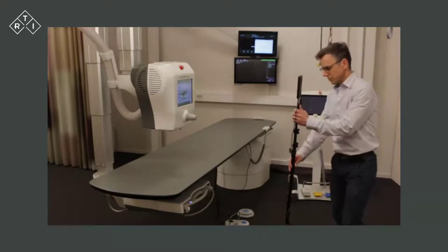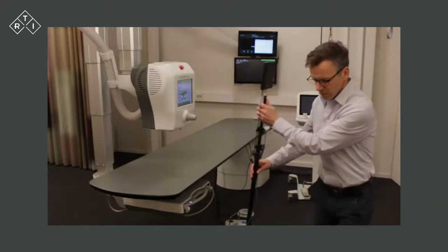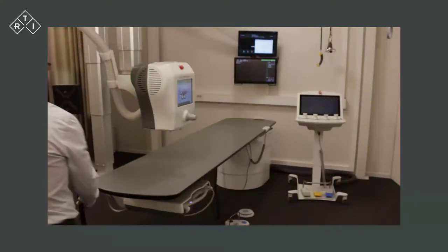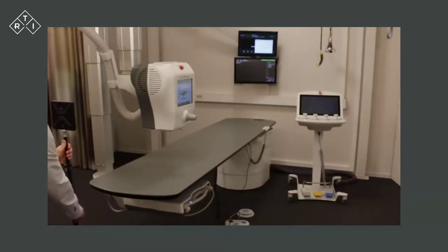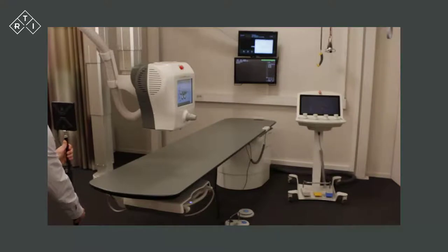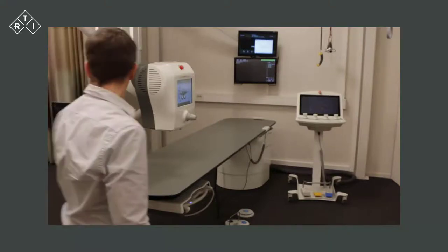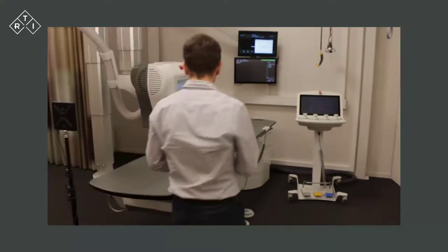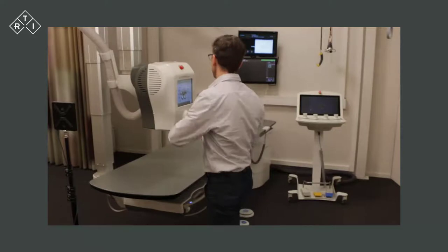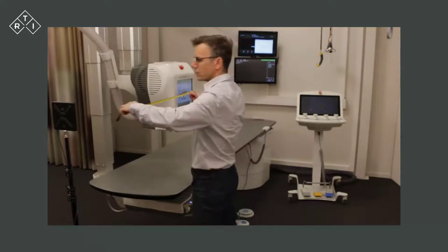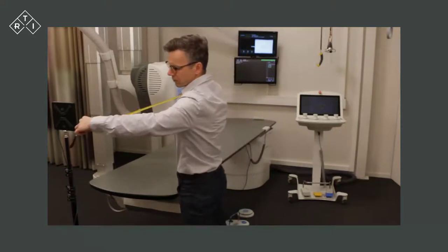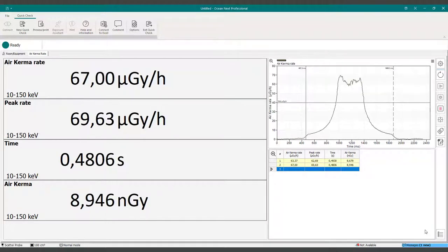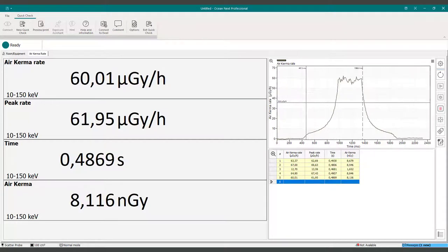After completing the exposure, move the RTI Scatter Probe to the second position, verify the distance and expose. Repeat this for the remaining relevant positions and calculate the total leakage according to a suitable procedure.